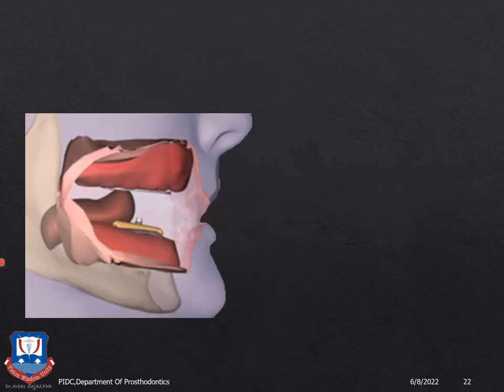Now, this is how an intraoral tracer looks. The central bearing plate is attached to the upper maxillary occlusal rim, and the central bearing plate with the plunger or styli is attached to the mandibular rim. And the patient is then asked to do protrusive, left lateral and right lateral excursive movements, and this generates an arrow on the central bearing plate on the maxillary.